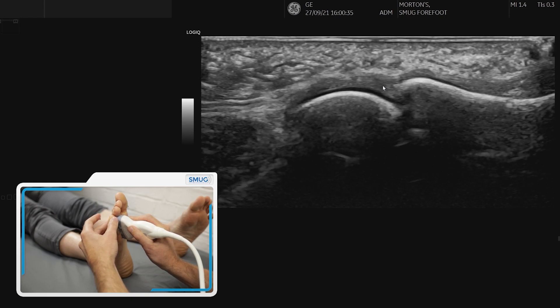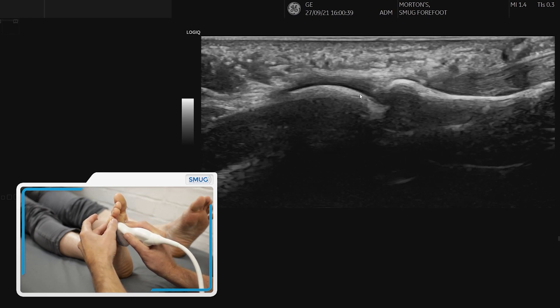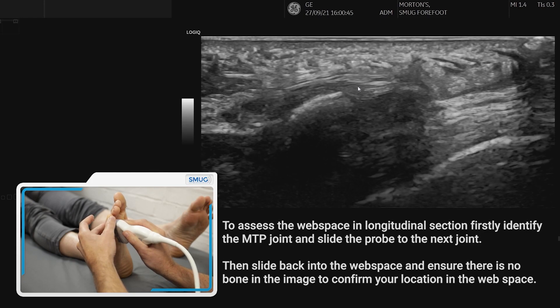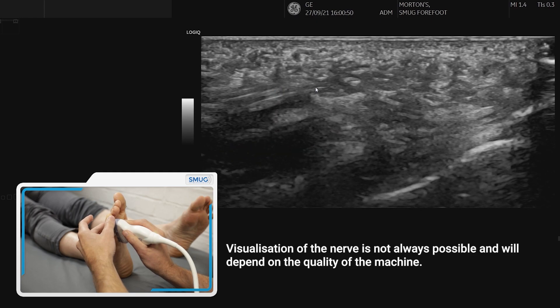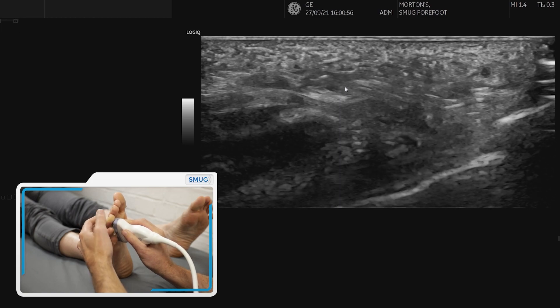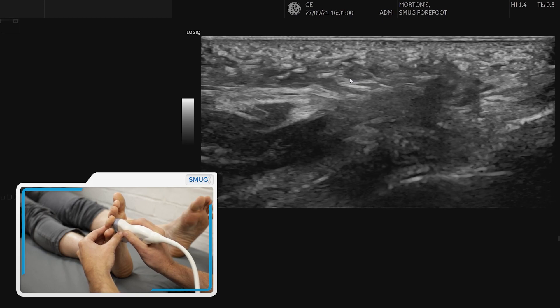Then we're going to move laterally to the fourth metatarsal phalangeal joint and interrogate the structures there. Moving back into the intermetatarsal space where there are no bones, we can sometimes identify the nerve. We also need to do a compression to determine whether this is a neuroma or a bursa.